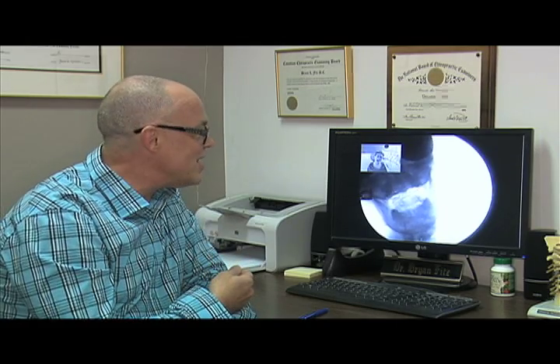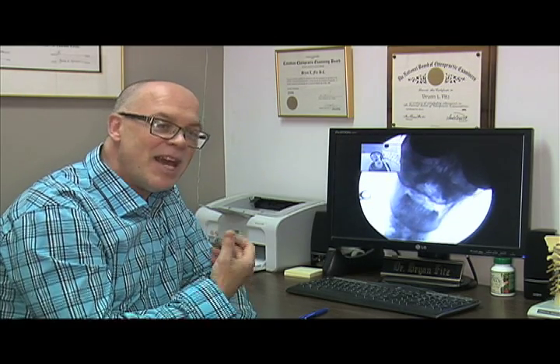So we show X-rays at North Edmonton Chiropractic Clinic, and we explain the difference between what their X-ray is and what a normal is, and if their X-ray is normal, then check mark, and they're happy. But if there's something that needs to be corrected, then at least we can see it and we can address it.